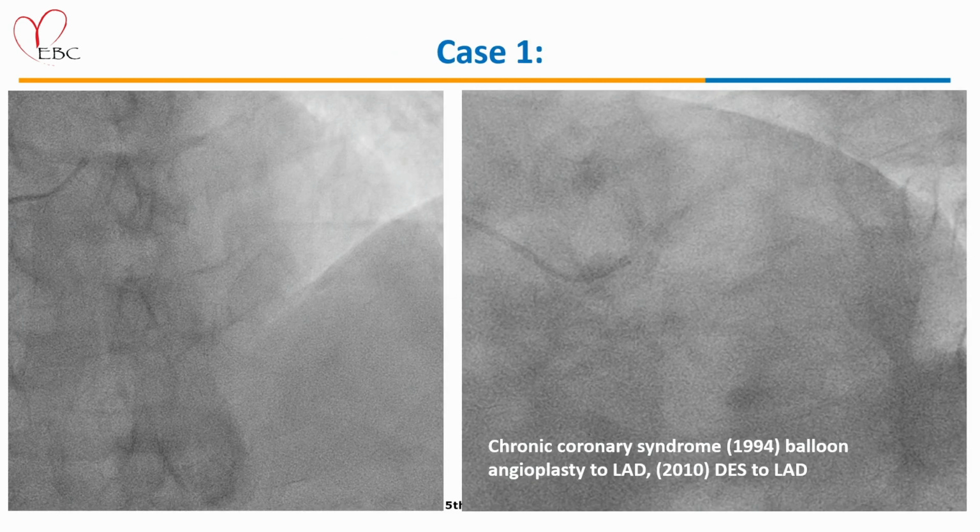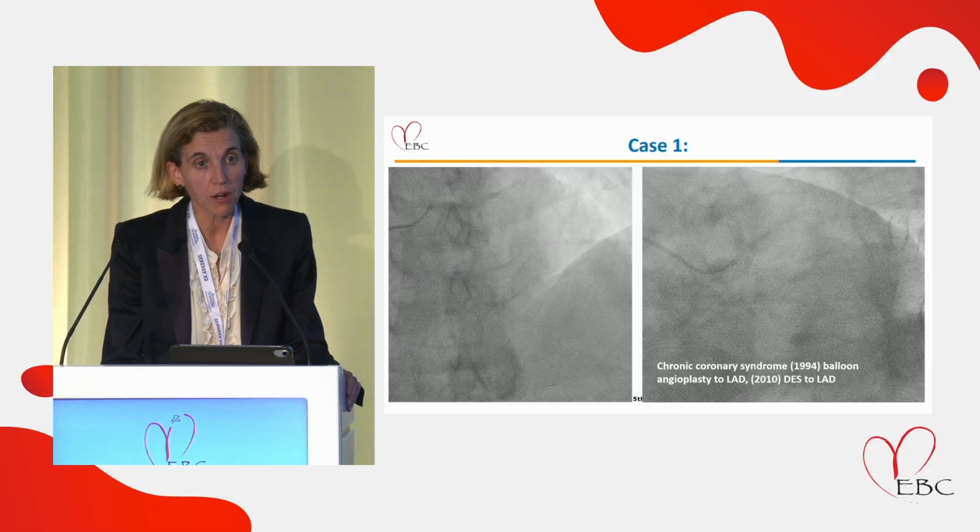I think in the last registry, they used a cutting balloon. The mean size was 3 millimeters. In my experience, in the LAD, we undersize the cutting balloon, because we don't see as many dissections as in this registry. But it's all the information we have.